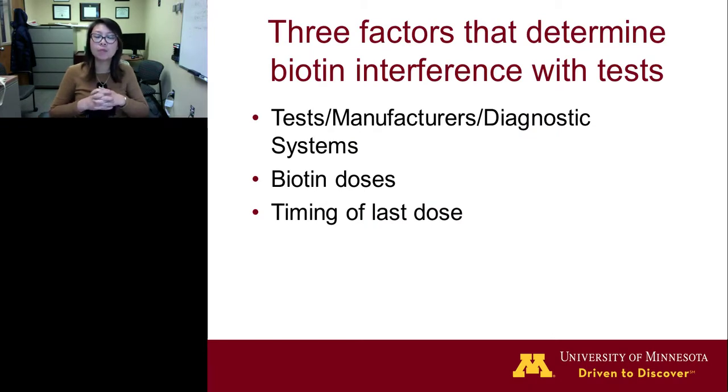So in this study, we evaluated many different systems and many different tests. From those two previous slides, you can see that some tests are more prone to biotin interference than other tests.